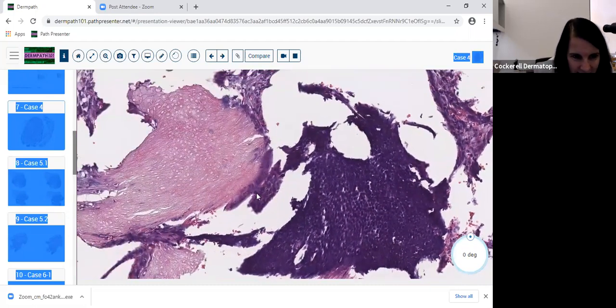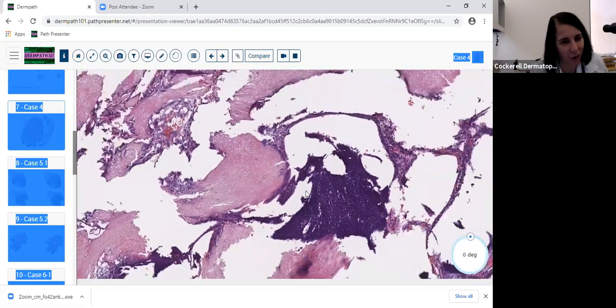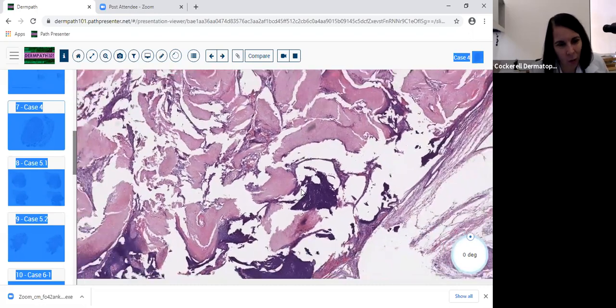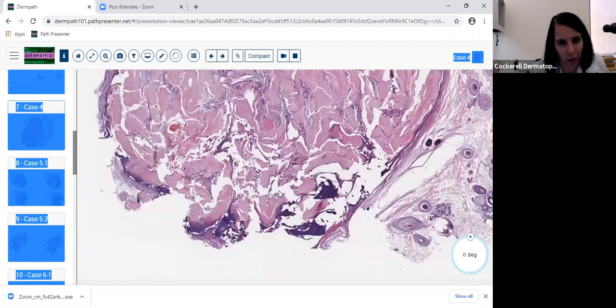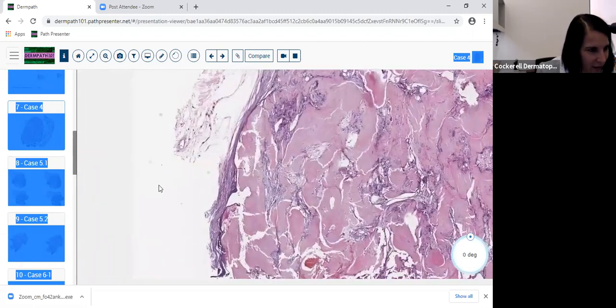And then I might see a little bit of keratin. And I had a case like that the other day. There was a little bit of keratin. I saw the shadow cells and I said, this looks like the surface of a pilomatricoma. So watch out, be very, very careful. So here's your pilomatricoma. Let's move on to the next case.